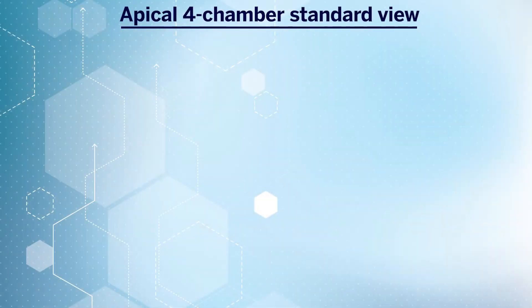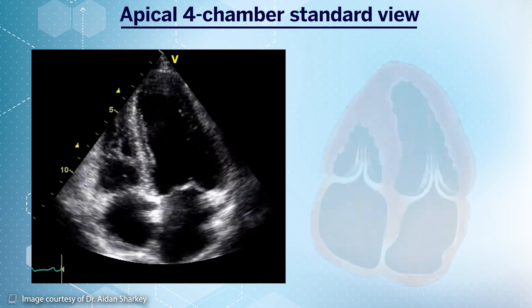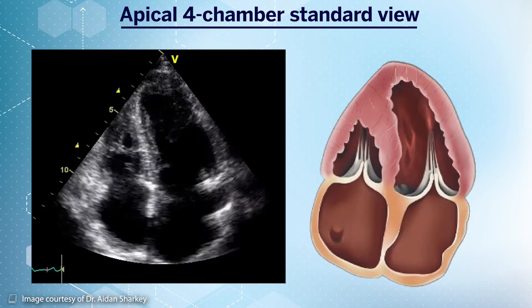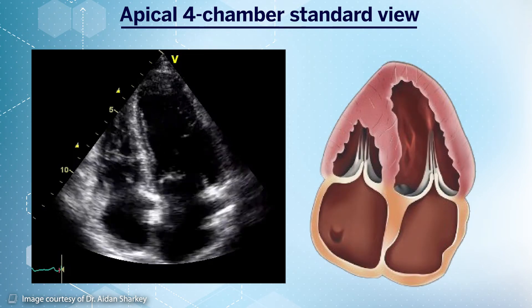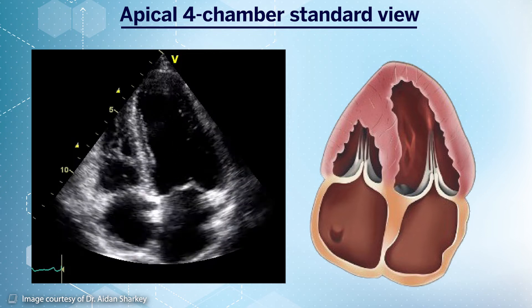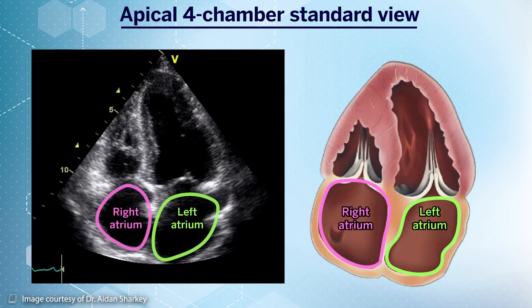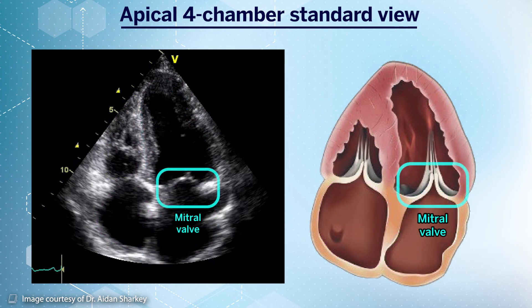The standard view obtained in this window should appear as depicted in this video clip and cartoon representation. Here we can clearly visualize all four heart chambers — that is the two atria and two ventricles — along with the mitral and tricuspid valves.